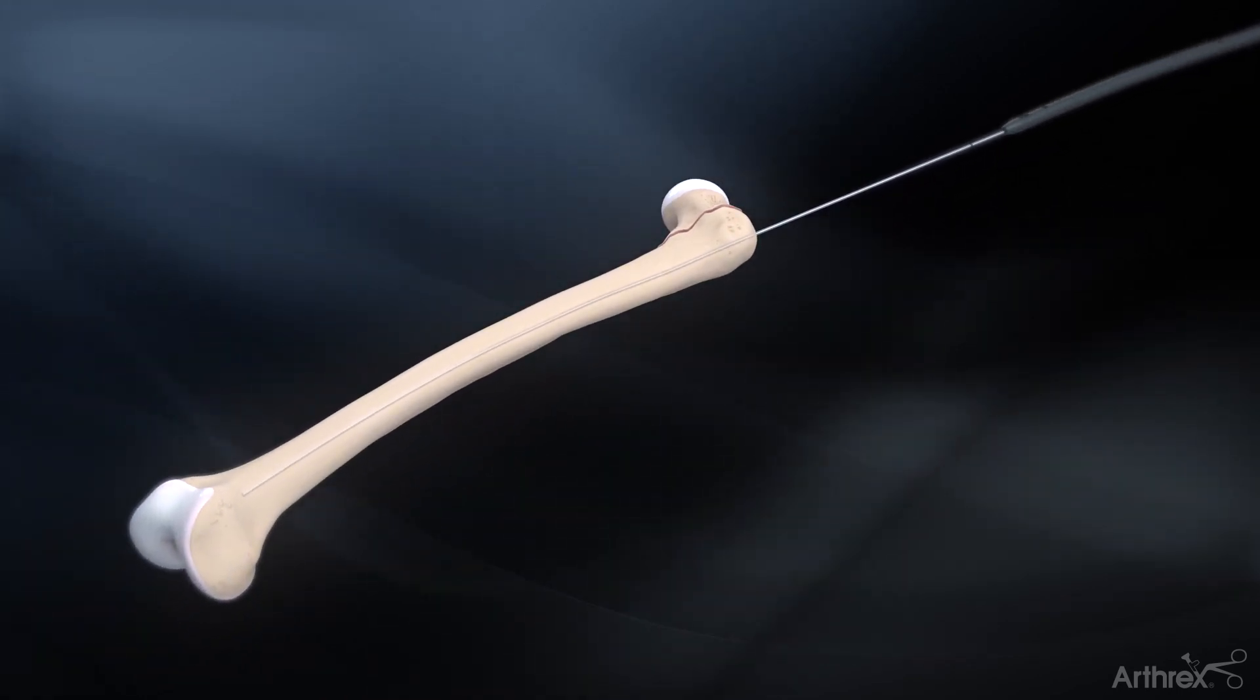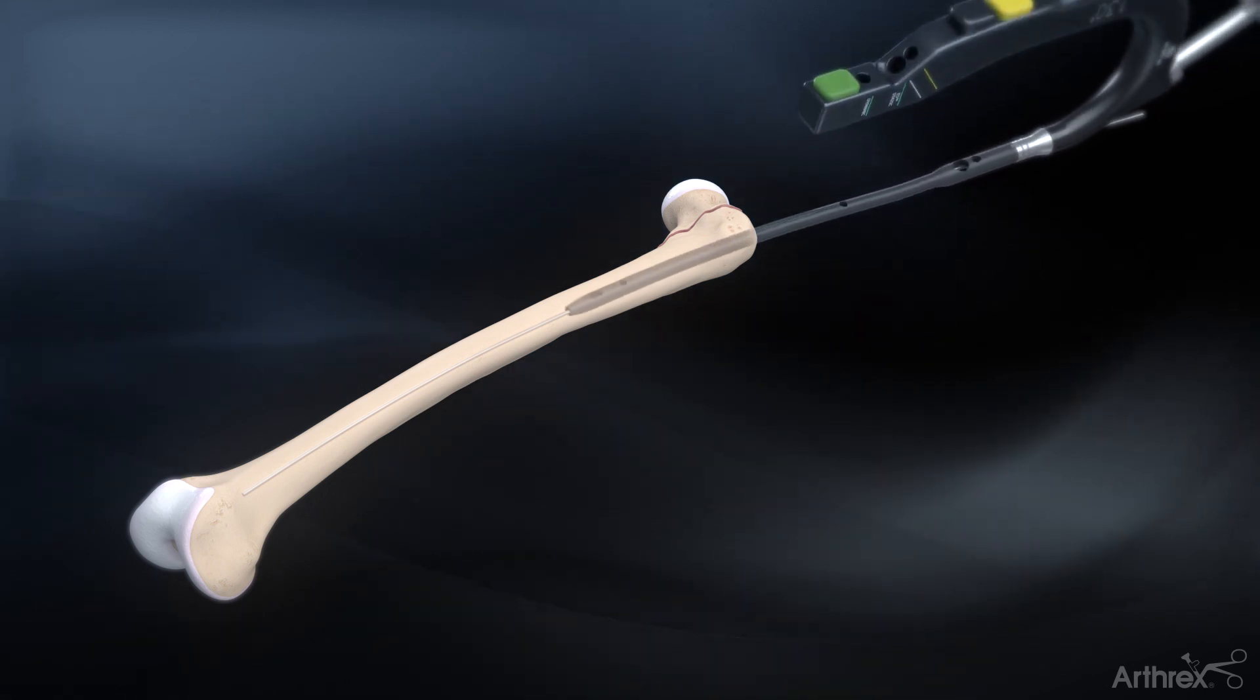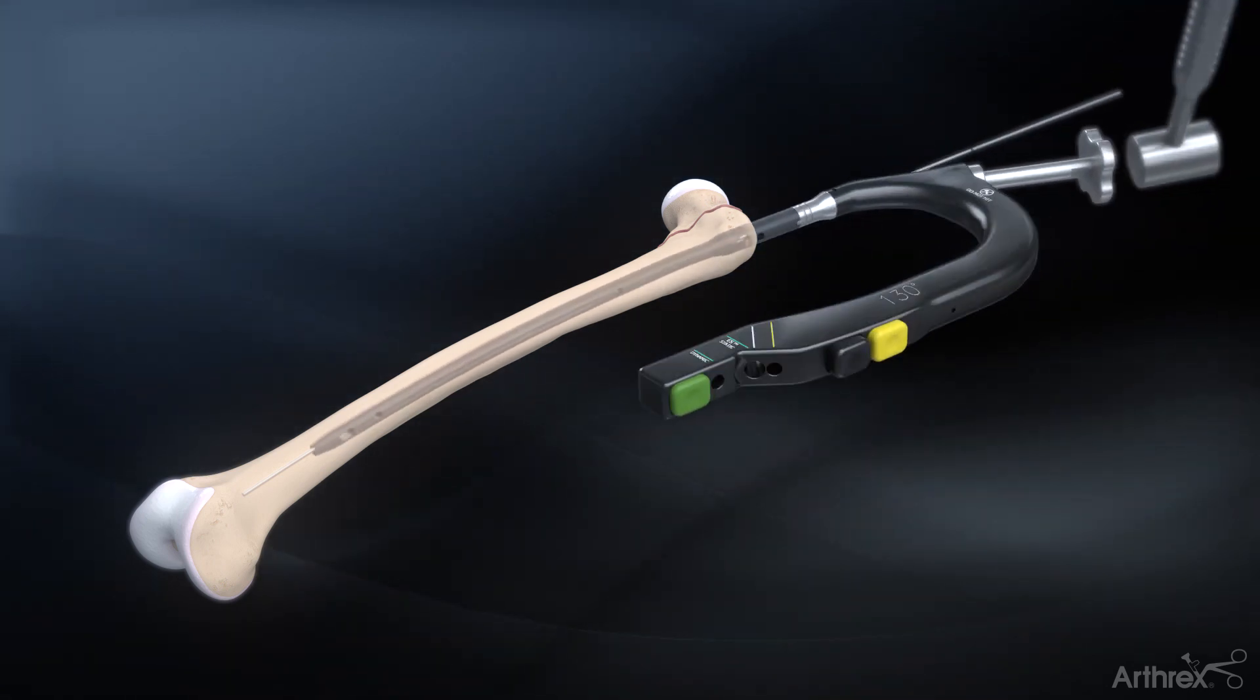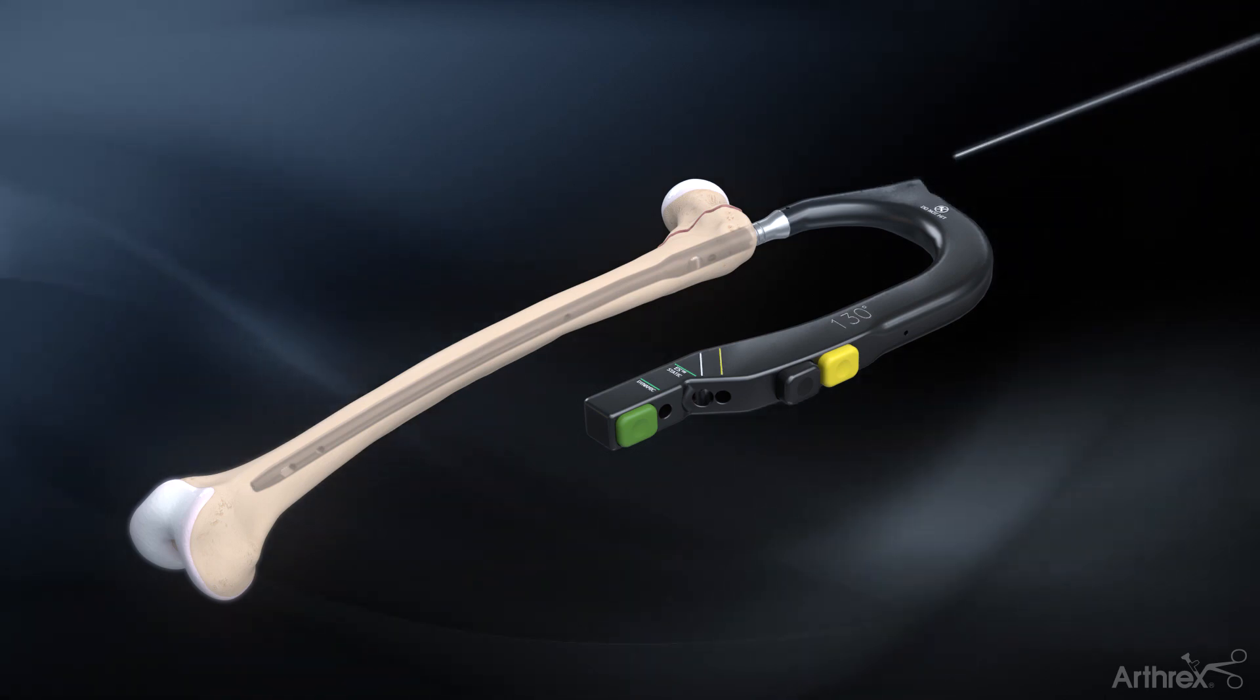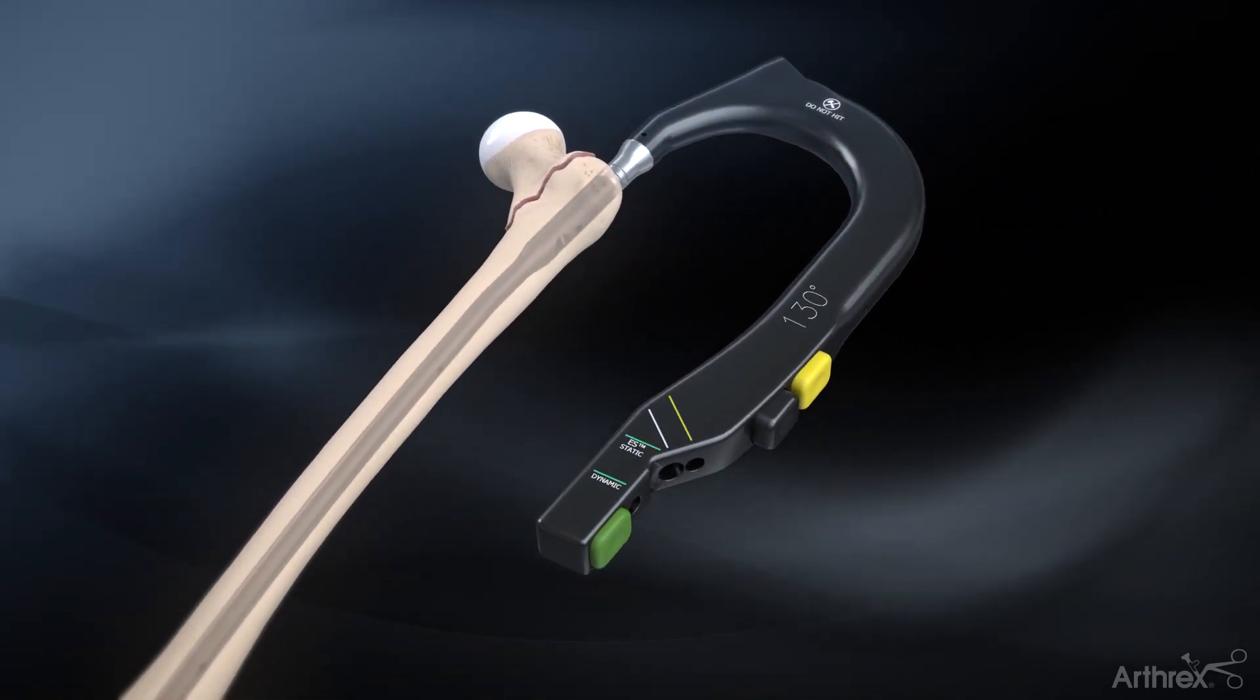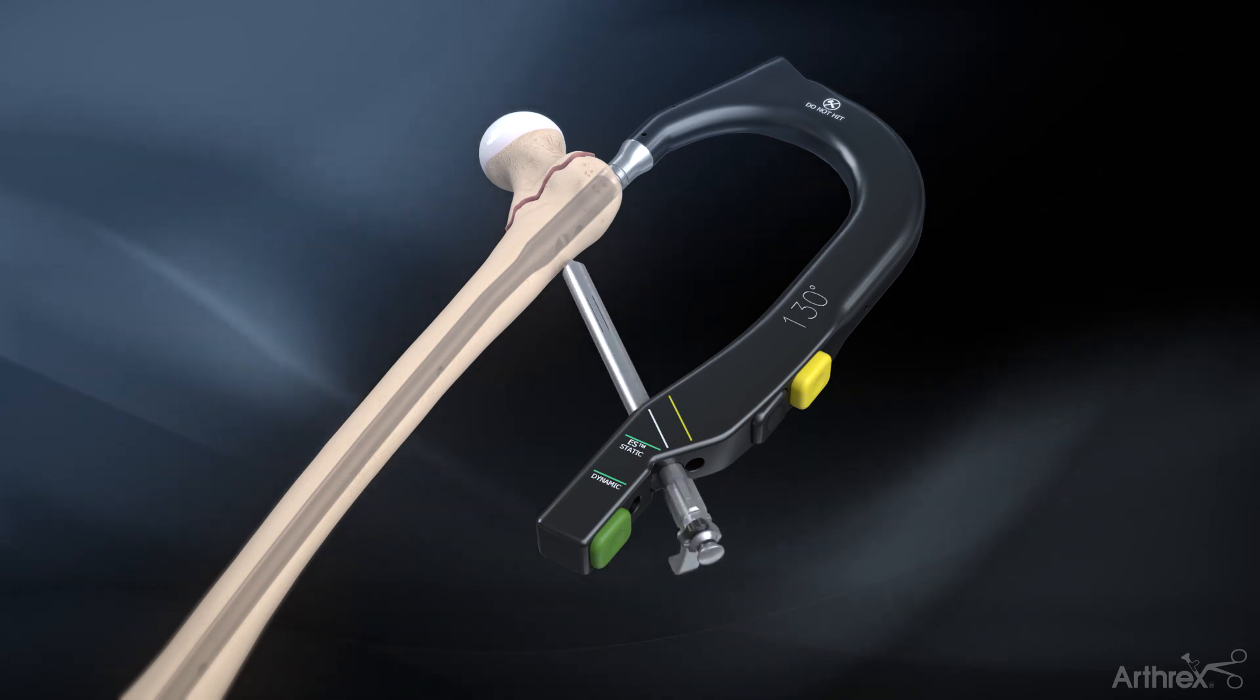Introduce the nail into the proximal femur over the guide wire using the radiolucent targeting arm to control nail rotation. Complete the insertion with gentle mallet strikes on the impactor pad. Once the desired nail depth has been achieved, insert the lag screw triple sleeve assembly through the targeting arm by pressing the black button. Slide in the assembly until it contacts the lateral cortex of the femur.